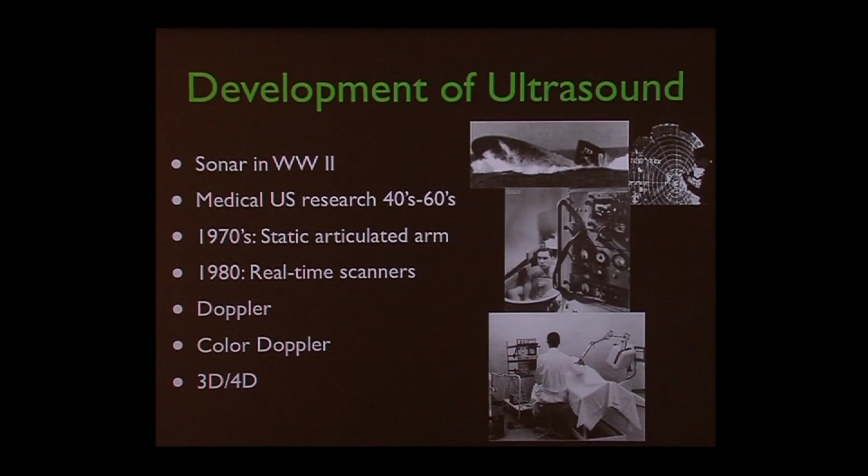A little bit about ultrasound. I'm going to spend not as much time on some of the other modalities, just because we don't have the time, but I'd love to, because I was involved in a lot of the early research with ultrasound too. And it came out of World War II, out of sonar. And eventually was made into a medical imaging device.